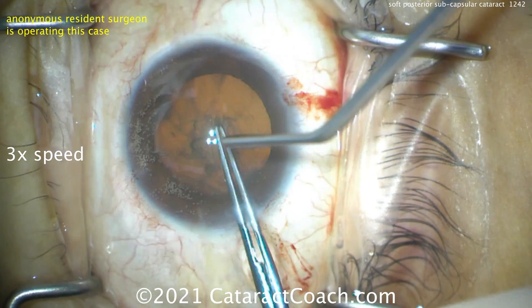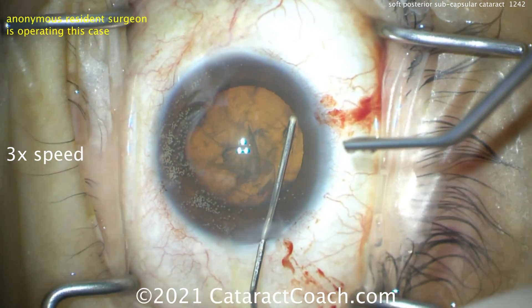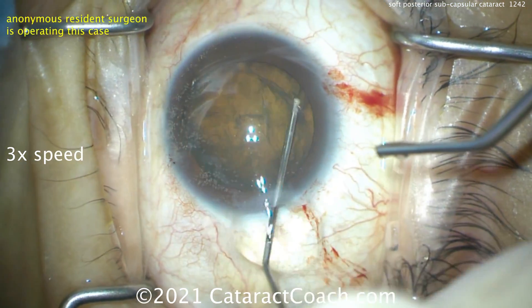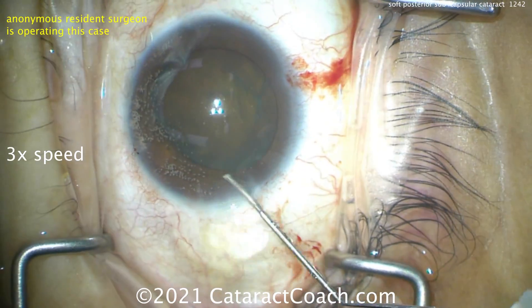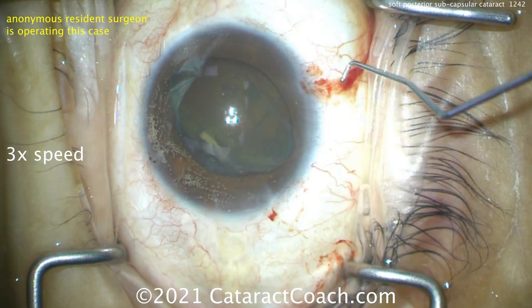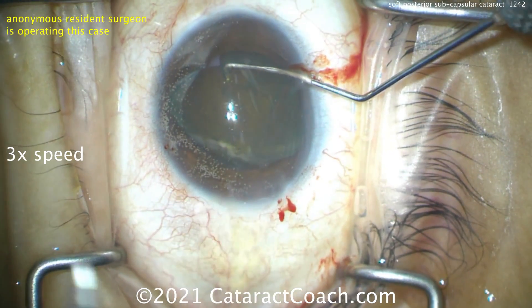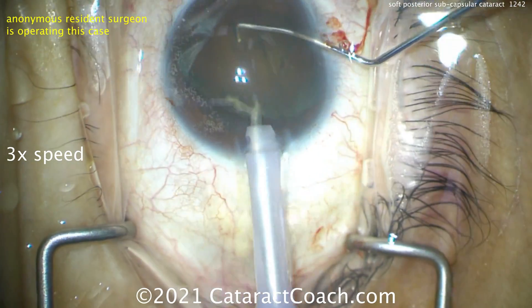And there you go — it's the rhexis. Now here's the key technique, ready? Hydrodissection, and hydrodissection, and hydrodissection. Watch — get the nucleus up, delineate it, get it out of the capsular bag. By doing this it's going to be very easy just to emulsify this thing.